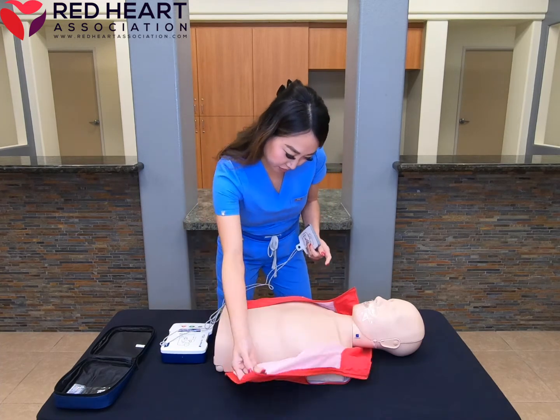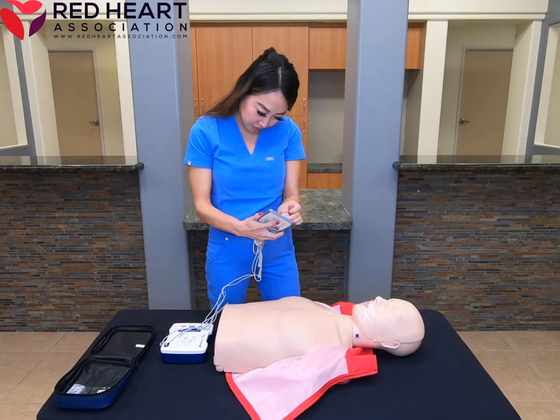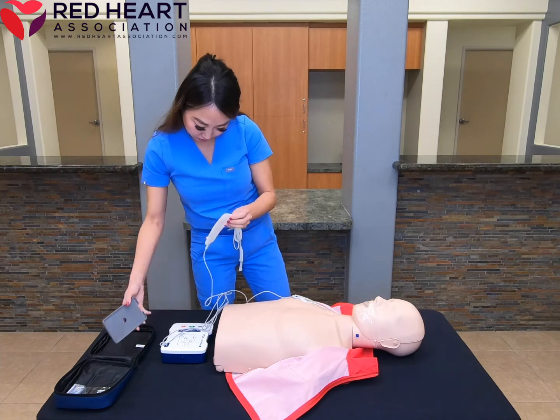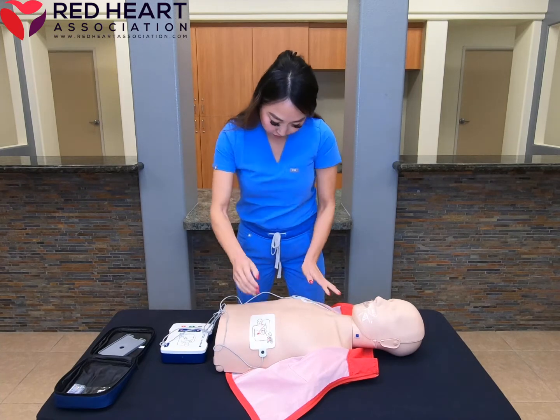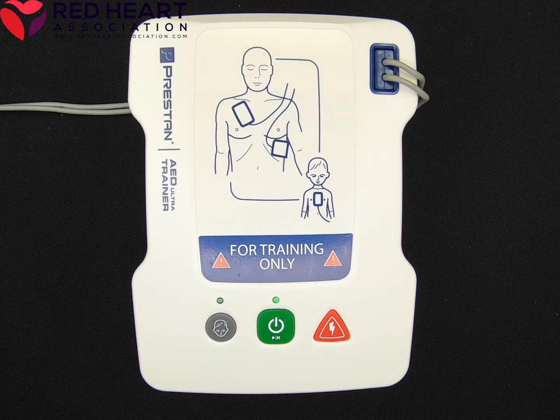Remove packet and apply pads onto patient's bare skin. Apply pads as shown in the pictures. Press pads firmly on skin.